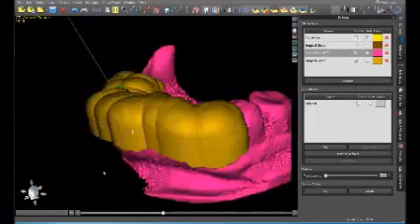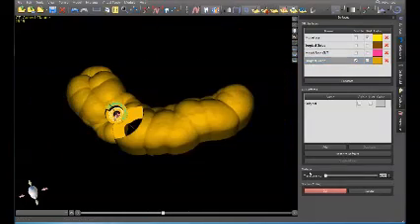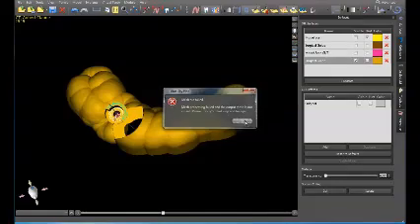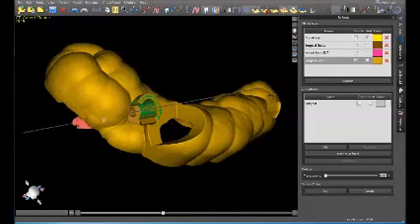And one last feature I've not talked about: you see how you can't really tell if the guide's sitting on the left side. All you really need to do is click on guide, click on cut, hold the shift down, and cut a little tiny hole right here. And then that's it. You'll be able to see it sit on this side of the guide. Now you save this data, then file export, and send that out to print, and you're done.